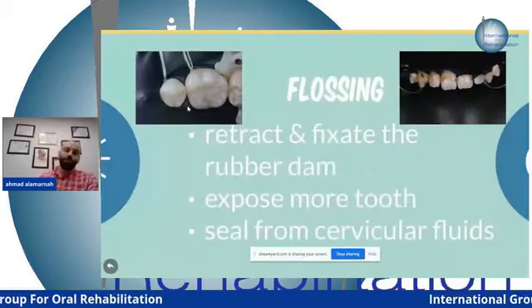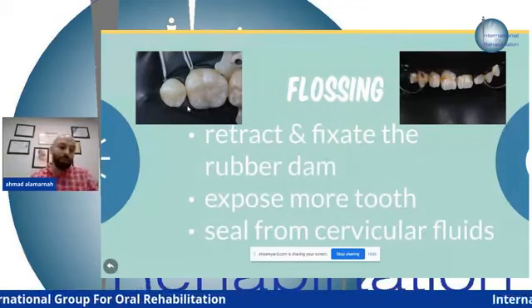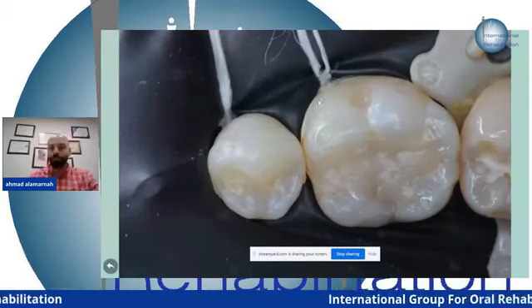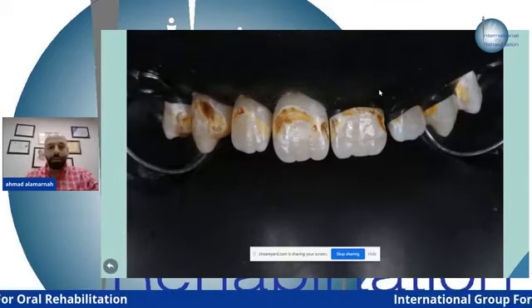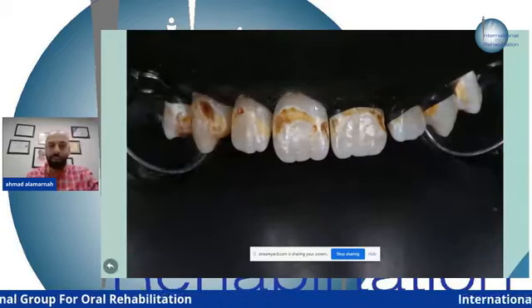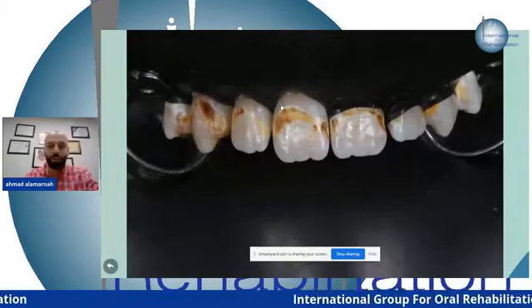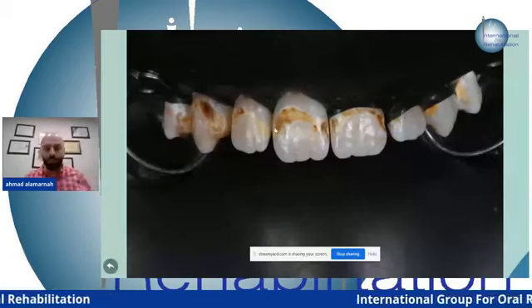Flossing, as we said before, will expose more of the tooth structure that you need to see, and also seal from the crevicular fluids. In this picture, like the previous picture, look at the exposure, more exposure. Look at the cemento-enamel junction here. This picture is a beautiful one for the anterior teeth. On the right side of the patient, the left side of the picture, the floss is inserted in the cervical area, and here without any flossing. Look at the difference. It shows the caries and the healthy margins, so you can establish your restoration at the healthy enamel or dentine all the time.